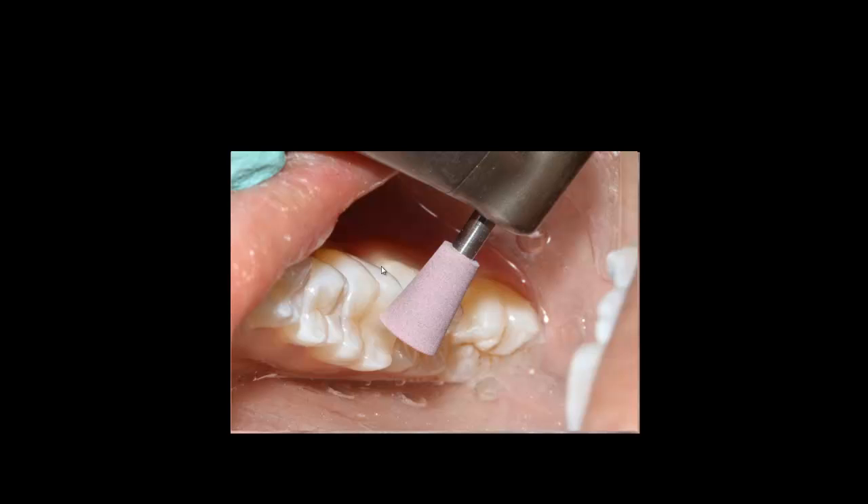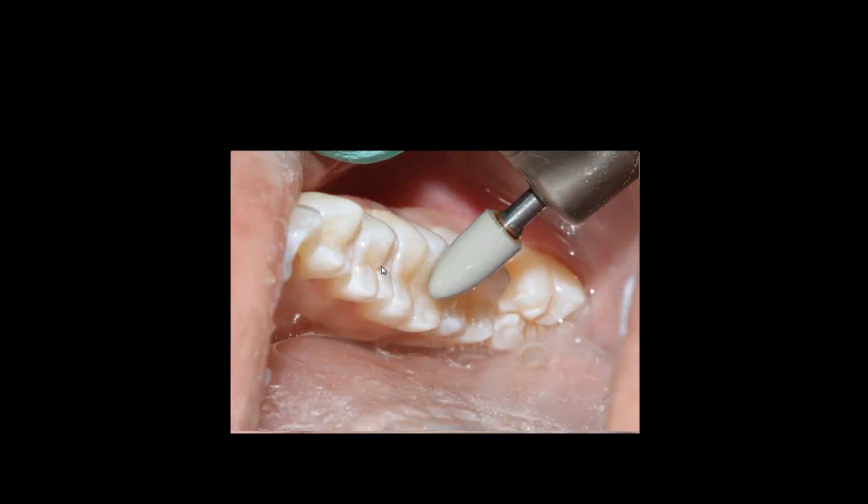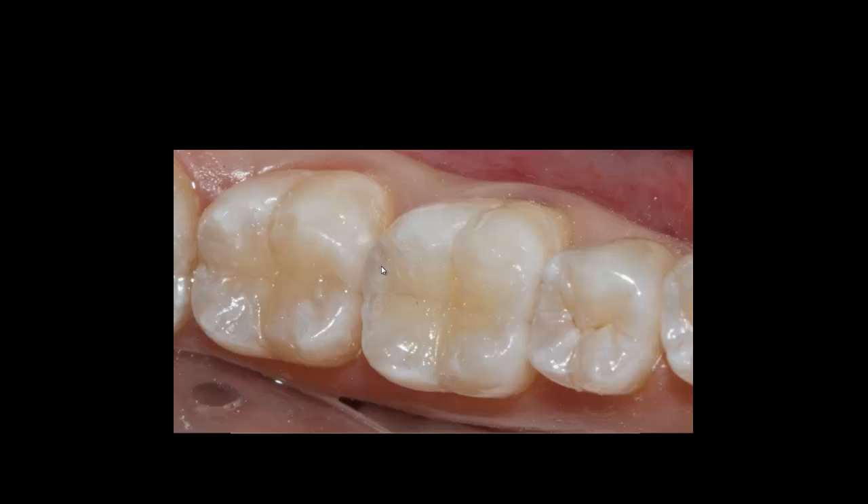Finally, I use the polishing kit provided by the company, starting with a high-polishing grade followed by a smooth polishing grade. The material polishes very well. You can see the final product in the close-up — it lays beautifully on the structure. The patient was happy and thrilled with the outcome. Thank you very much.